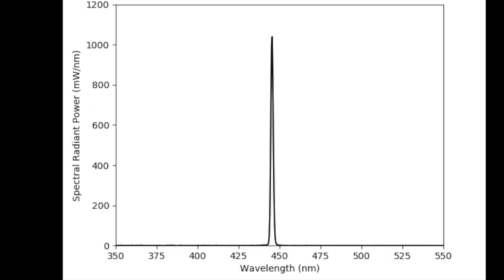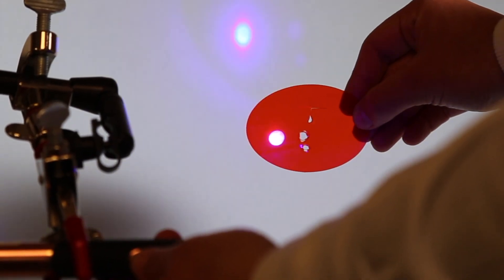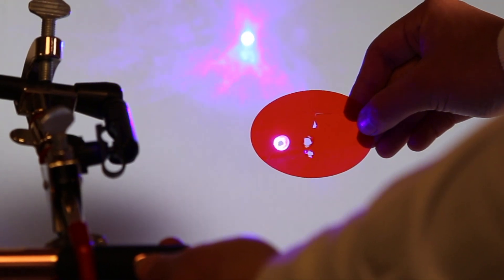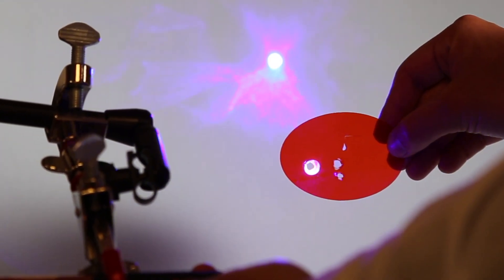A simple demonstration such as this can show you the power from this particular curing light. Here we have a cure through shield and we're just doing multiple one-second exposures onto the shield.